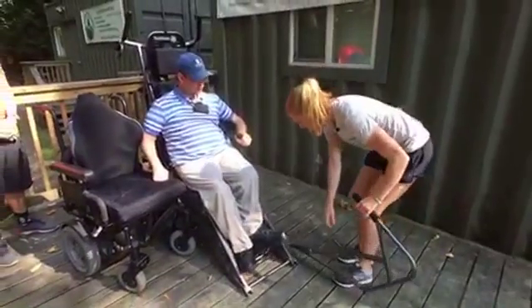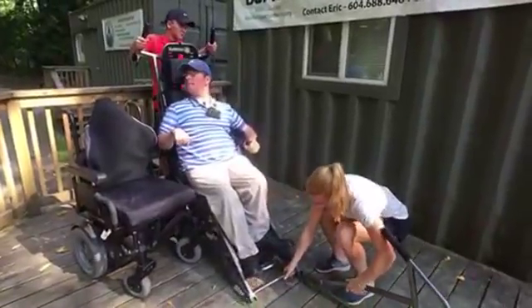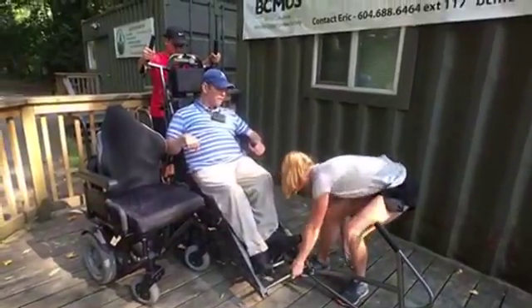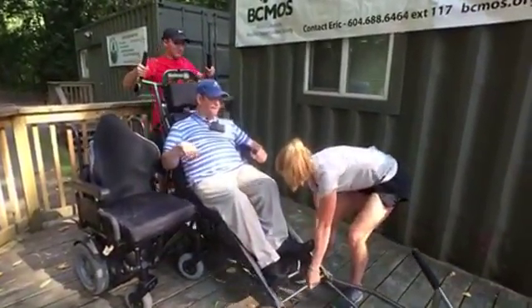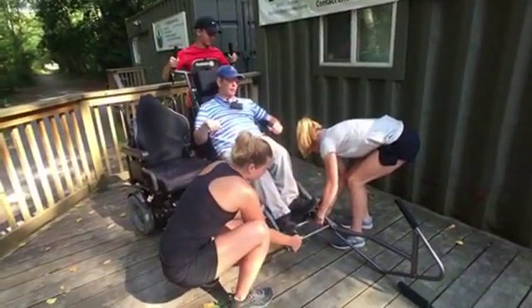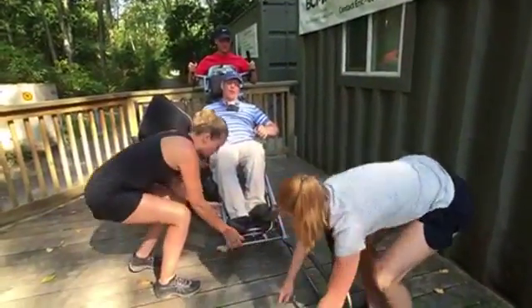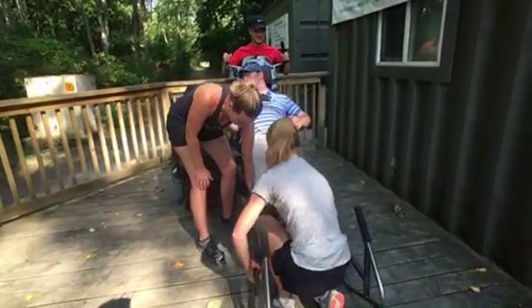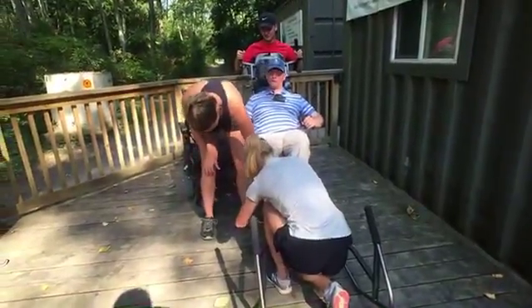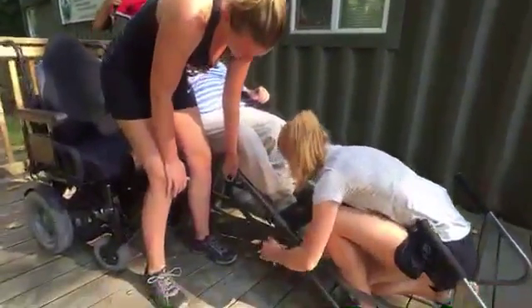So then I'm going to put these back on here. Maybe Colin, can I get you still at the back a little bit? Sure. And as you can see, the Trailrider is all held together by locking pins. And it's a durable aluminum. So if you're a Sherpa, it's easy for me to say, but I always hear people say the Trailrider itself is not as heavy as it looks. No. Probably about as heavy as it looks.